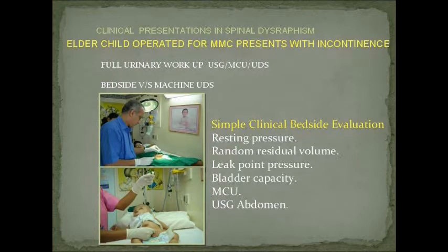We collate, we put all this information together and arrive at a probable urodynamic conclusion. And I want to just mention here that a few years back, one of my postgraduate students and I did a dissertation where 25 patients of this type were sent for machine urodynamics, and the findings in an experienced center, the same center doing all the studies, and this conclusion was sealed in an envelope.